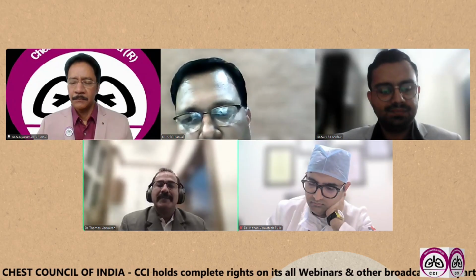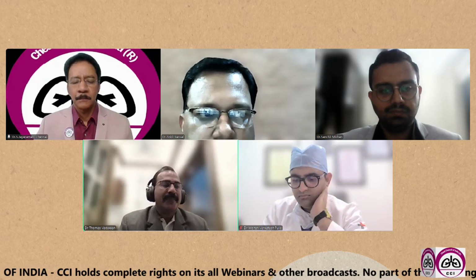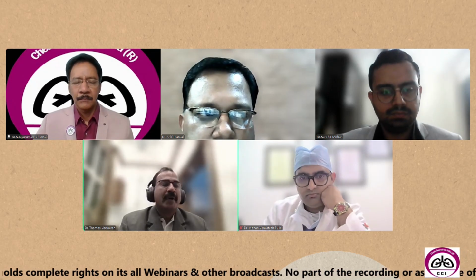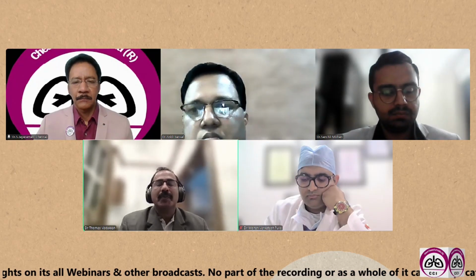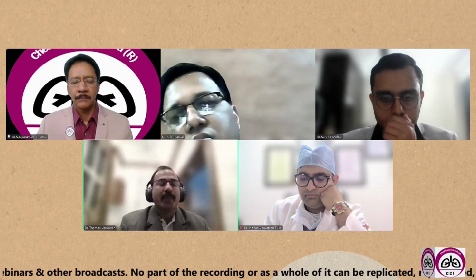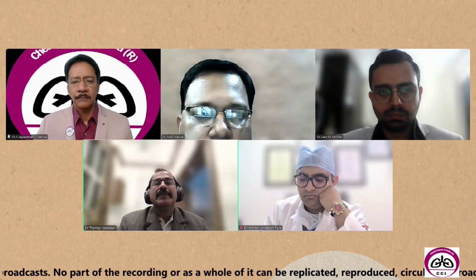Second thing is false negatives. The FDG uptake may be positive, but our EBUS may be negative. There are many factors: maybe a necrotic node, a fibrotic node, or a calcific node. All those things contribute, and the operator technique is also important. The experience of the operator is the most important. And some nodes, as already discussed, like para-aortic and sub-aortic, are not accessible with our conventional EBUS.